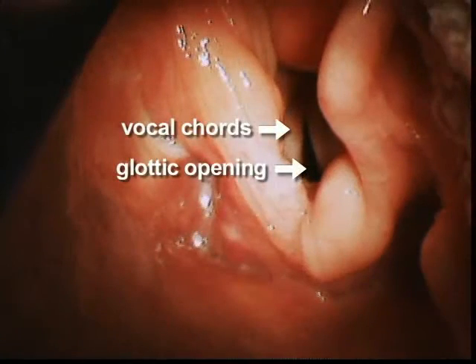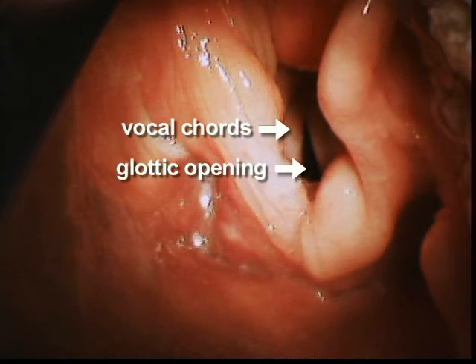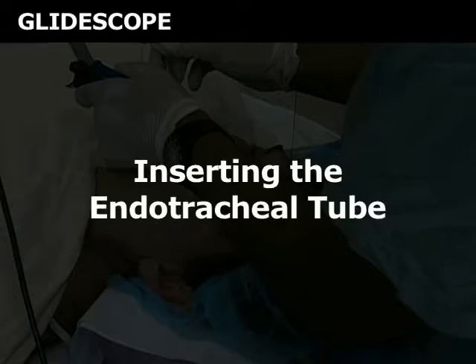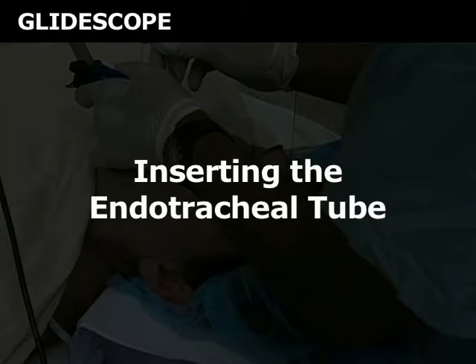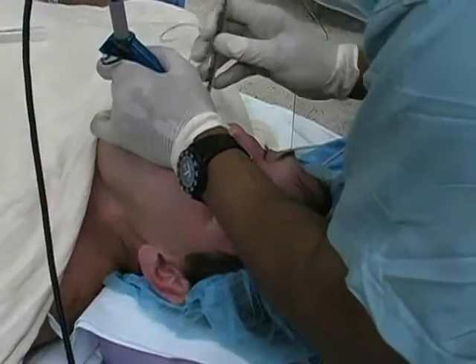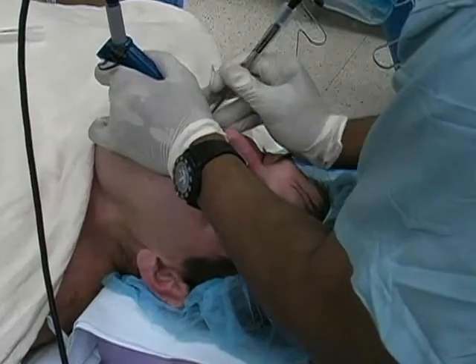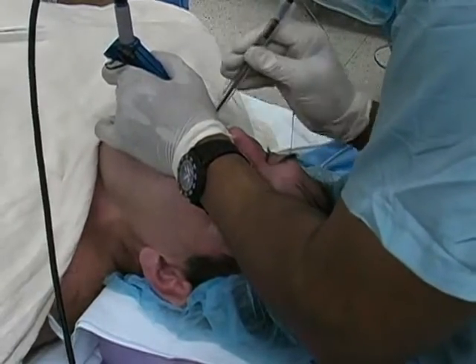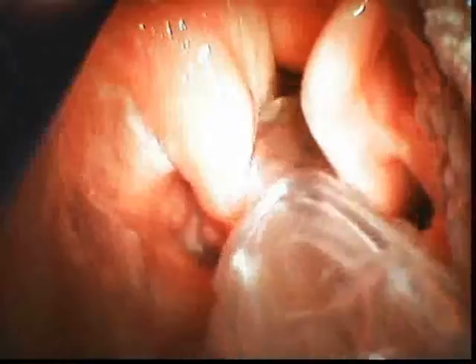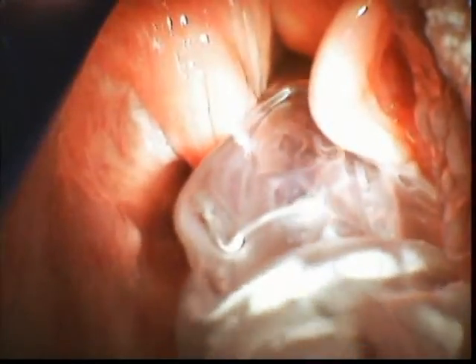Visualize the glottic opening and the vocal cords on the display screen. Place the endotracheal tube on the right side of the patient's mouth and advance it toward the glottic opening. Continue to use the display screen to guide the tube through the vocal cords.